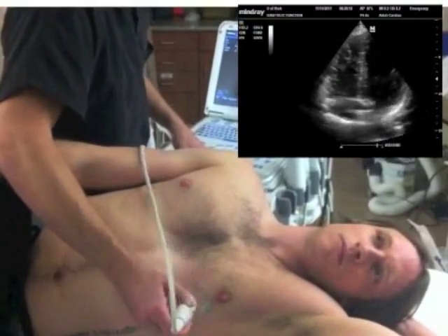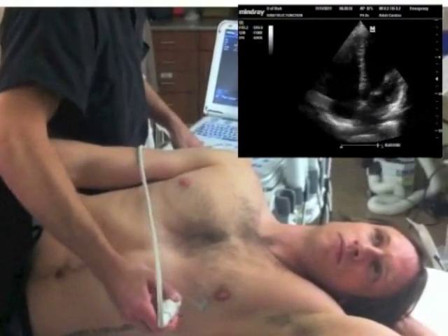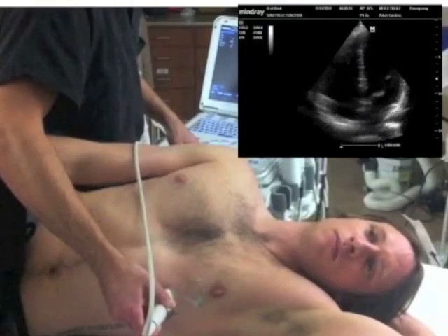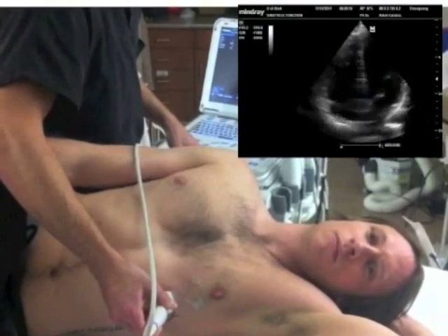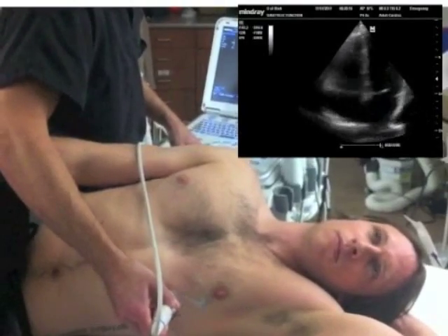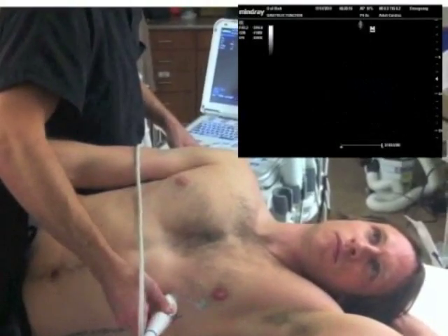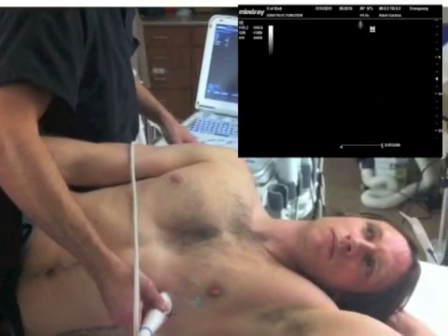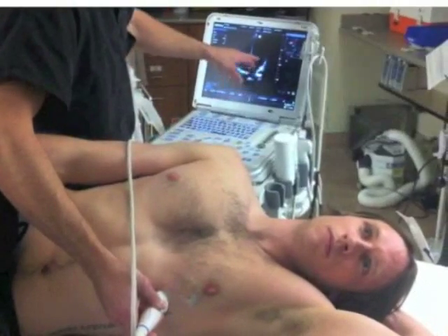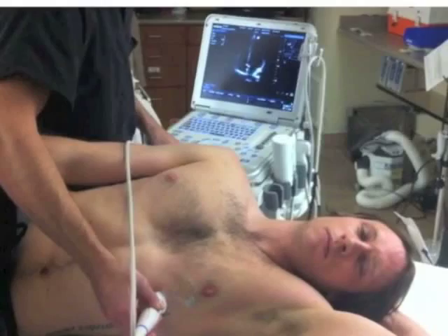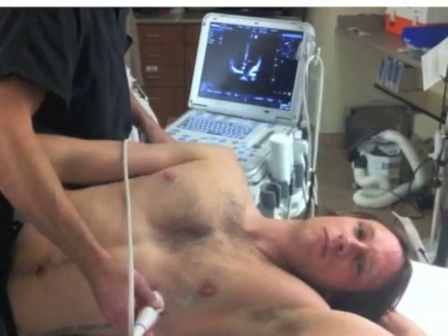Sometimes you might even need to go down to a different intercostal space. Here I've actually gone down an intercostal space and the view is a lot better now. I can see more of what I'm looking for, and there's that inflow of that mitral valve, really good right there.